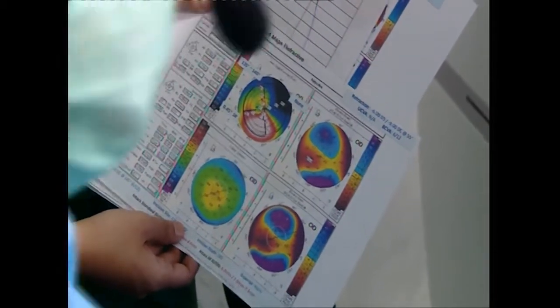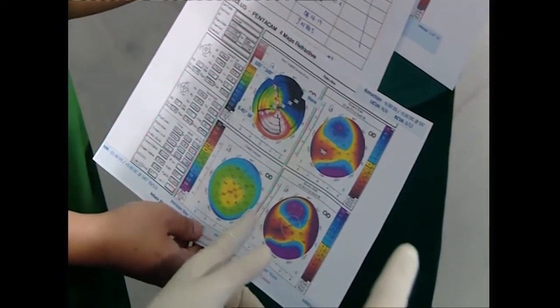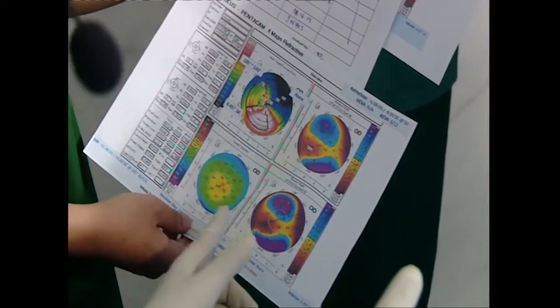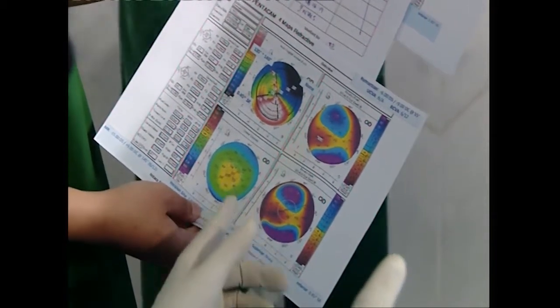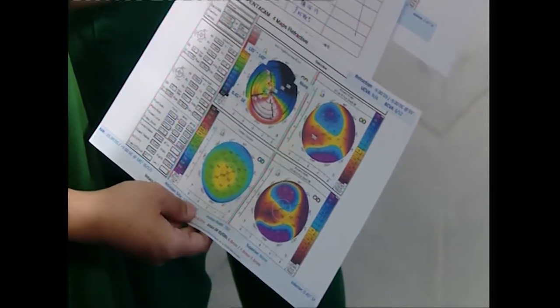I think you have not yet heard Gitansha's talk on the segment planning, right? So let me explain to you. If the cone is a centered cone, here if you look at the posterior float, within the 3 millimeters, less than 50%, not even less than 50% is actually there. So it is a decentered cone. So that's the first thing you have to define. It's a decentered cone here.